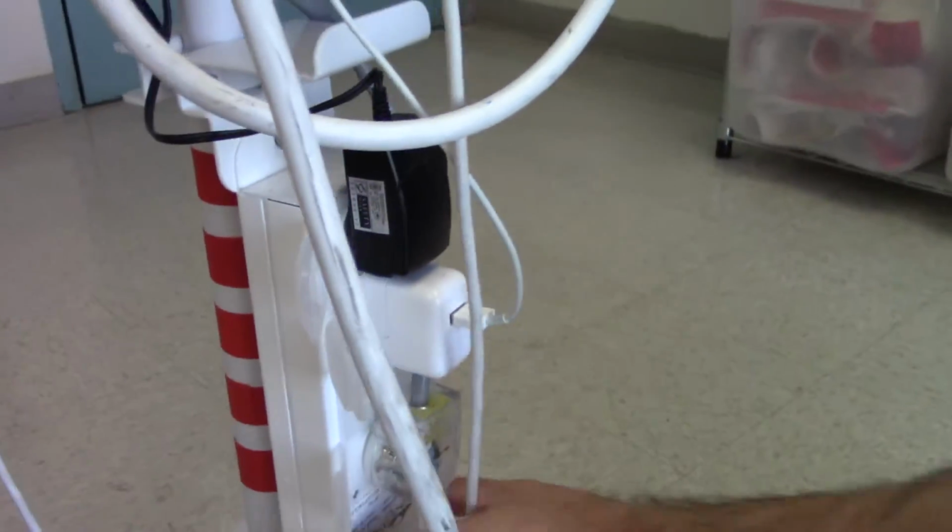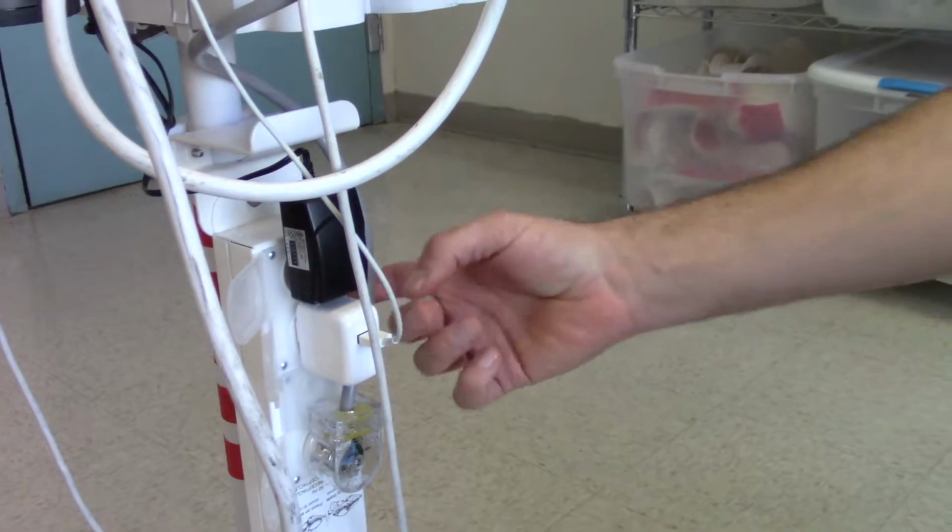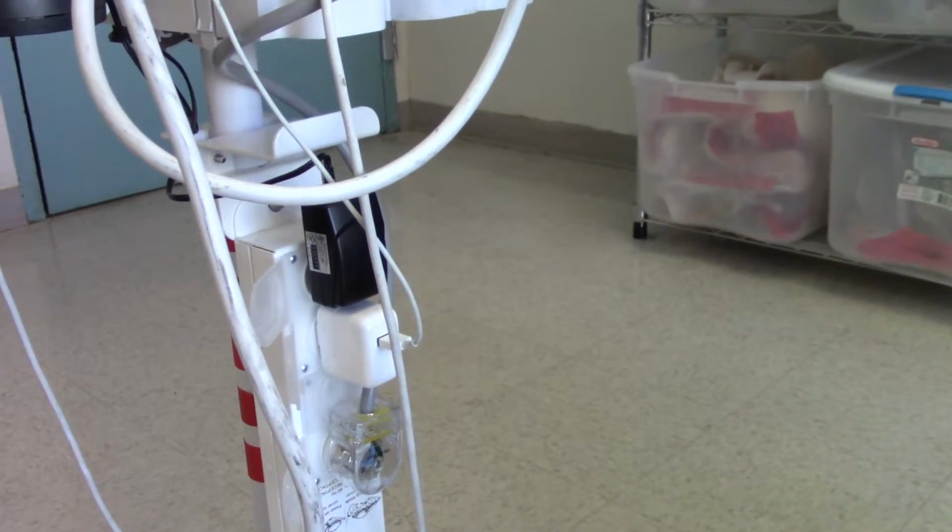Dynamaps, as you can see over here on the, well, we'll look at that in a moment. We can look at the Dynamap. The Dynamap has a different model. On the Welch Allyns, they typically use this Levitron model. I'm also looking for a price, and I'll include that on the list.